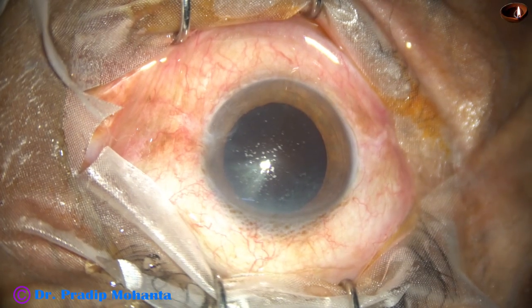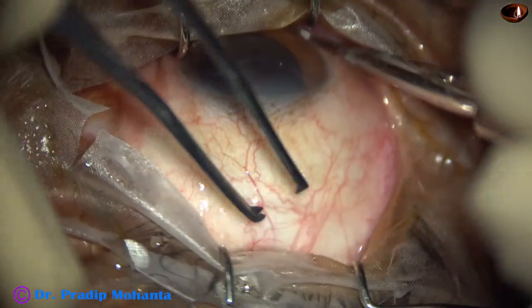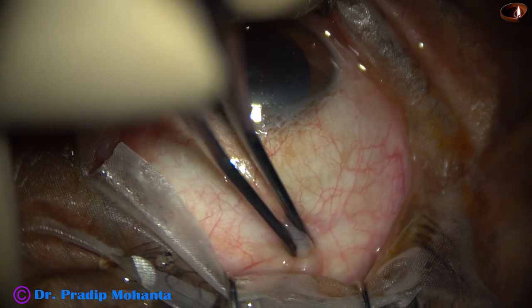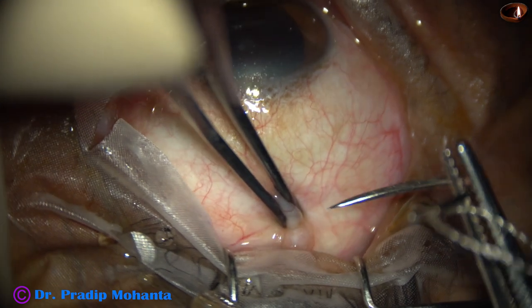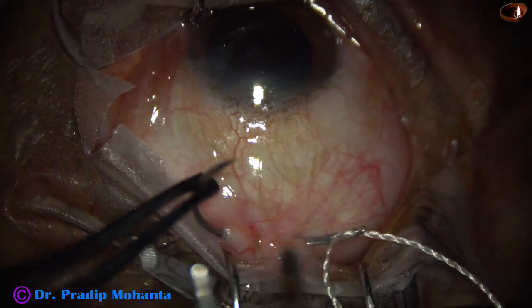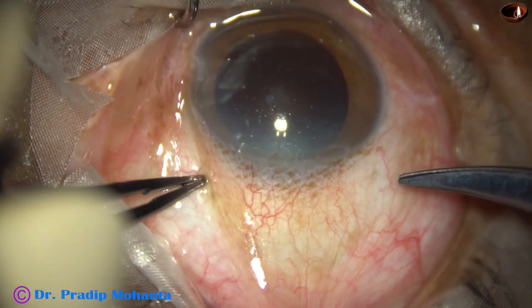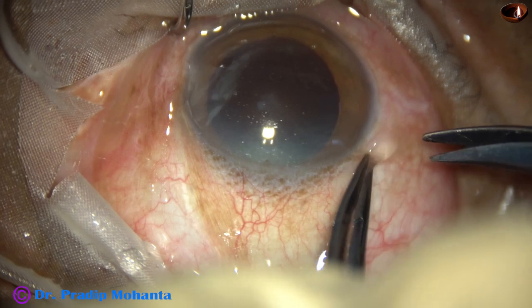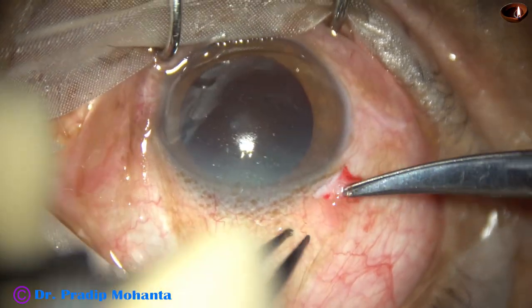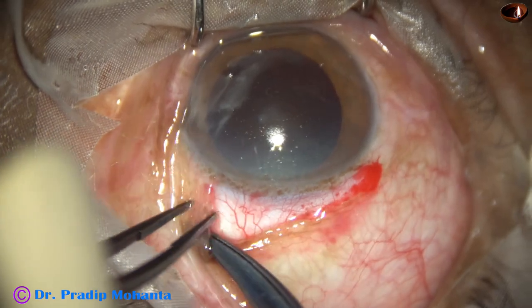In this video, I am going to describe ECCE, that is extracapsular cataract extraction, with just two sutures. I remember in 1995, when I started ECCE, I used to cut along the limbus for about 10 millimeter, incise hard cataracts and remove the cataract in toto. I had to put about 7 to 8 interrupted sutures or a continuous shoelace suture to close that wound. Today, I will show you that such a big incision can be closed just by 2 sutures.